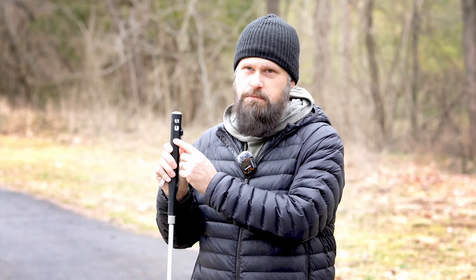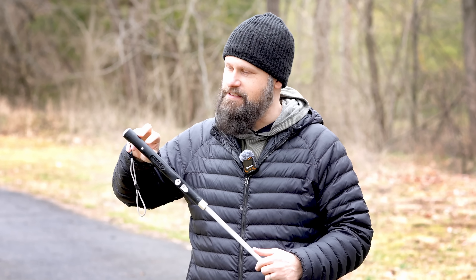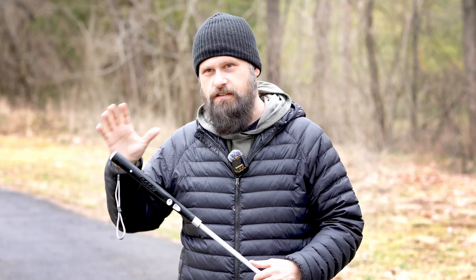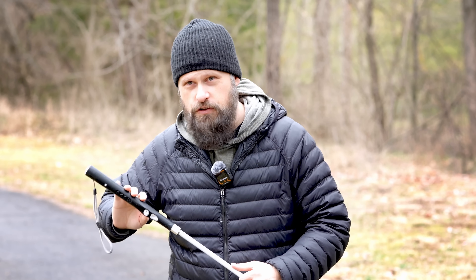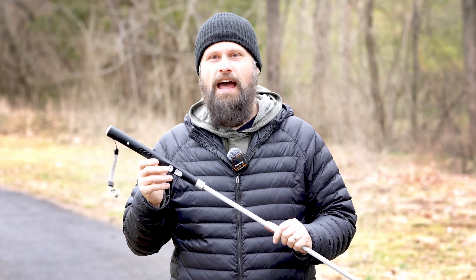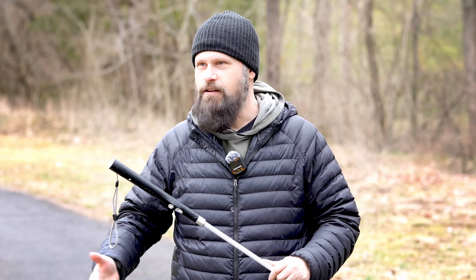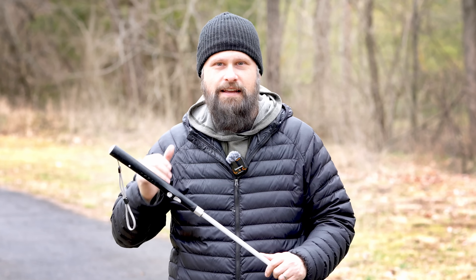We also have a new charging port — now using USB Type-C. There's also a microphone on the back, and that is for one of the newest features of the WeWalk Smart Cane Version 2: the ChatGPT AI integration. Your cane will have an AI assistant that you'll be able to interact with and get whatever information you need in the moment.